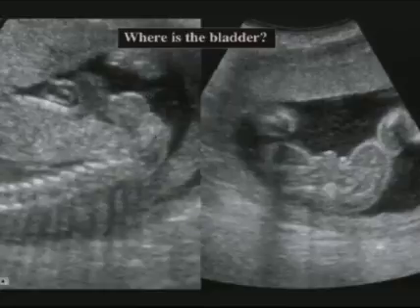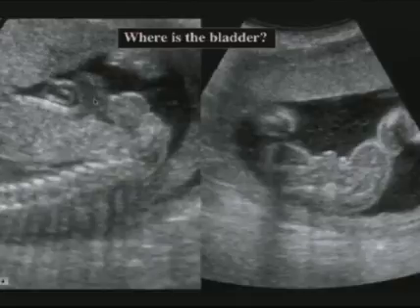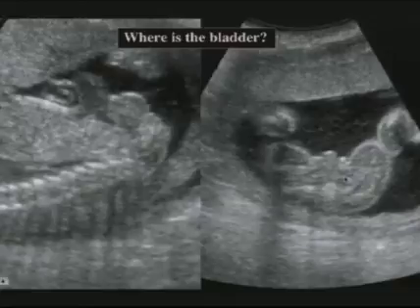Now here we are in the lower aspect of the fetus. This is the lower end of the spine here. And then we have the insertion of the umbilical cord right here and the genitals, but we don't have a bladder. Now the genitals do look somewhat abnormal, and I'm not really sure if we can tell whether it's a boy or a girl here, but there is no bladder.